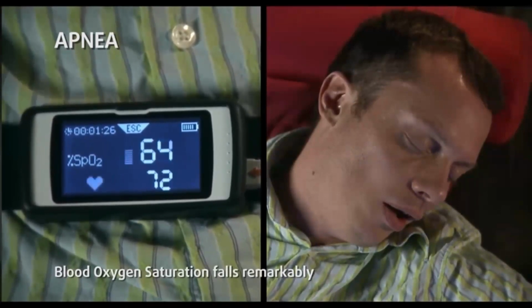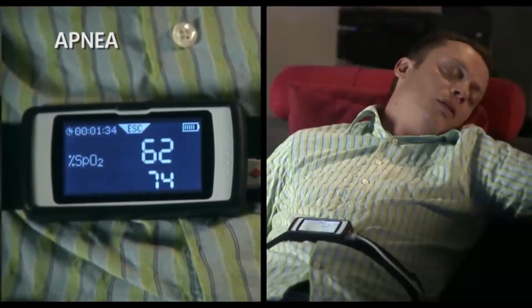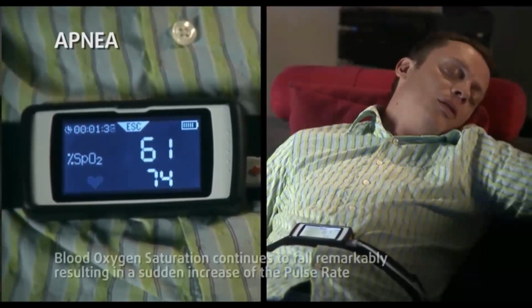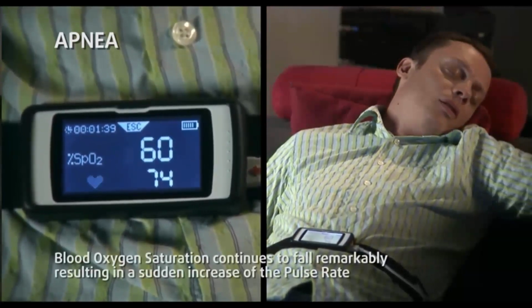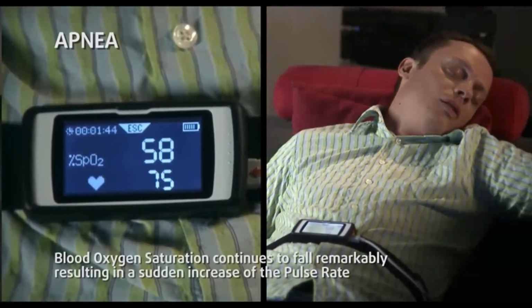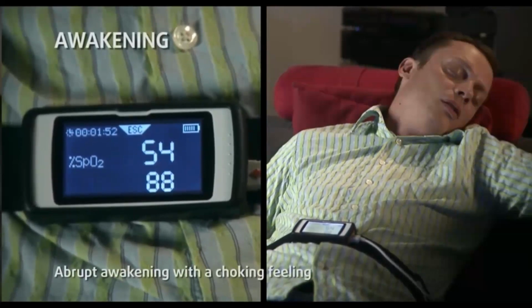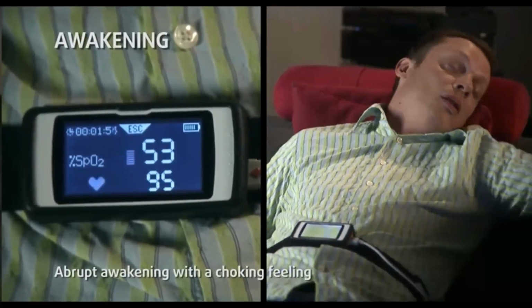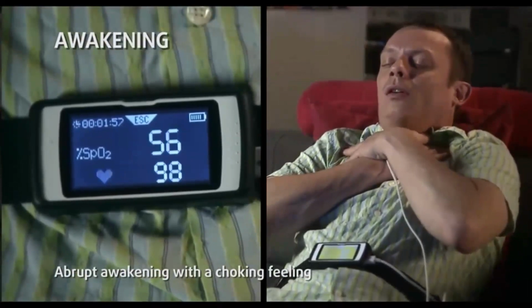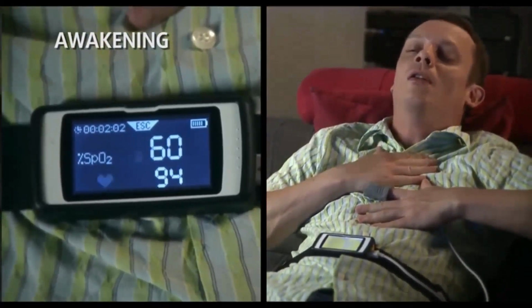And then now the heart rate, you can see the heart rate jumping up a little bit. There's adrenaline released. And then all of a sudden, there's going to be a massive spike of all of that. You'll see the heart rate really spike and he'll gasp and snort eventually. This is all still like not breathing. It's like being choked. There's no breathing right now. This is all complete blockage. Look at that oxygen. This is like really severe. Normally we don't see it this dramatic. This video obviously is a very dramatic one. Finally wakes up. Notice the heart rate shot up, almost got to 100.